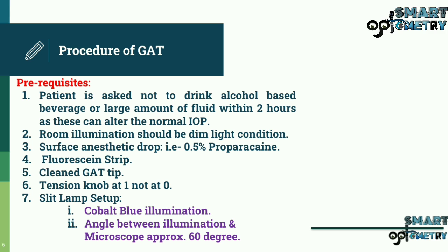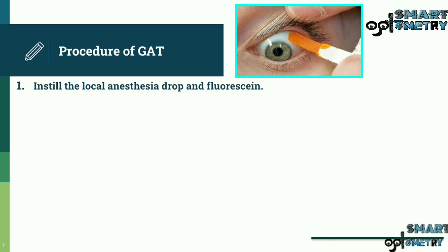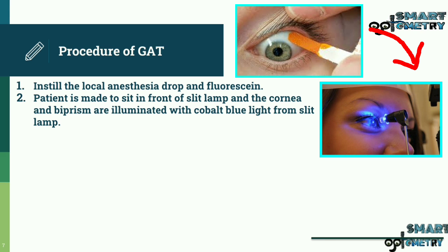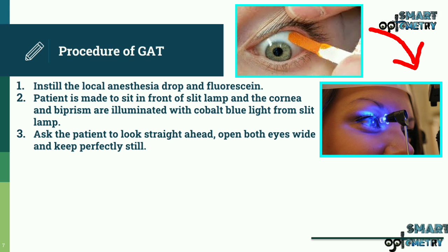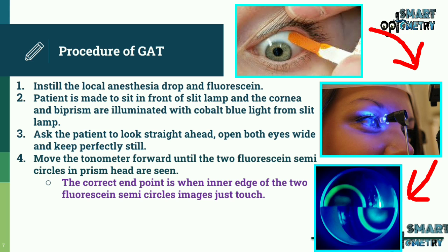Slit lamp setup requires cobalt blue illumination with the angle between illumination and microscope at approximately 60 degrees. Instill the local anesthetic drop and fluorescein. The patient is made to sit in front of the slit lamp, and the cornea and biprism are illuminated with the cobalt blue light from the slit lamp.